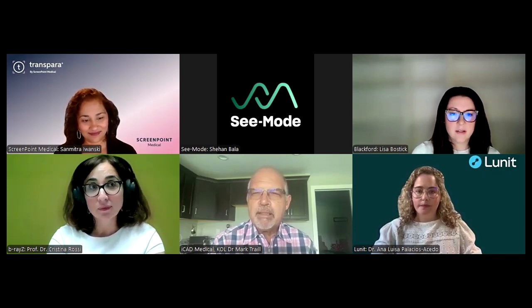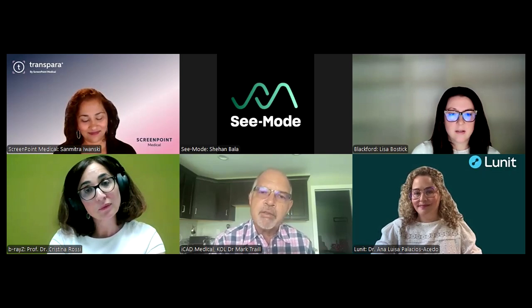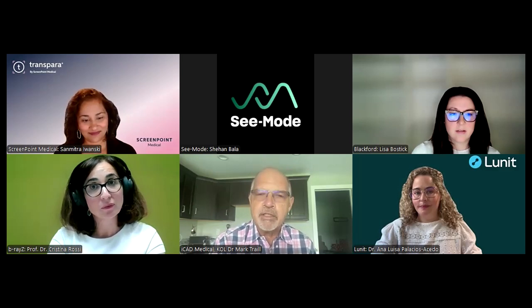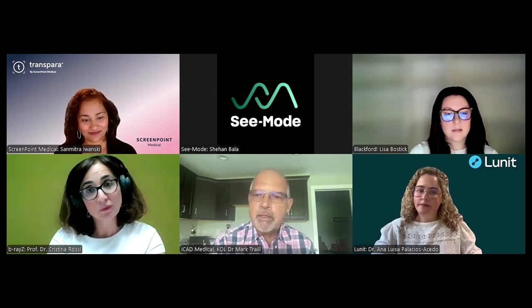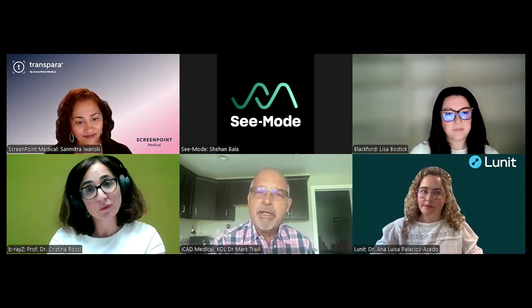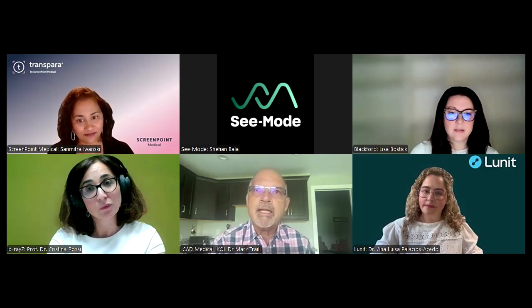It's hard to say what it's seeing, but the proof is in the pudding, and the research results across the board are indicating all the same, that the algorithm can pick up subtle changes prior to human detection. And a comment that I really want to agree with is change over time. I really think that metric, as was just mentioned, when you can compare an area score, either detection or risk, over time, you're adding a lot to the predictability.